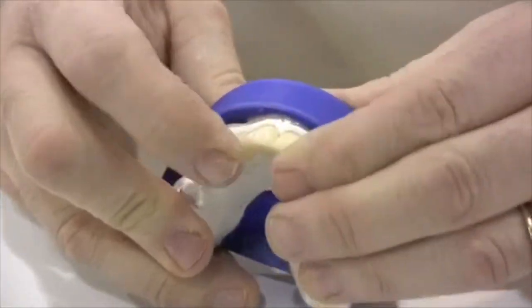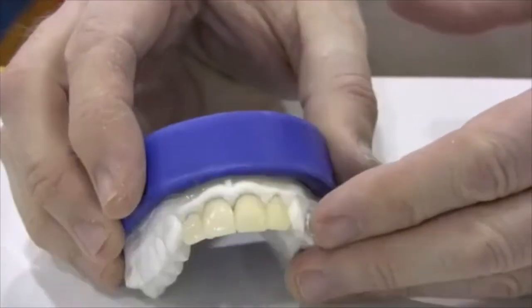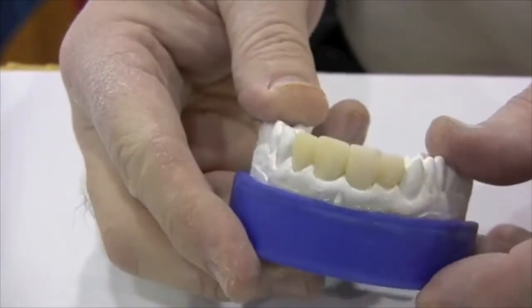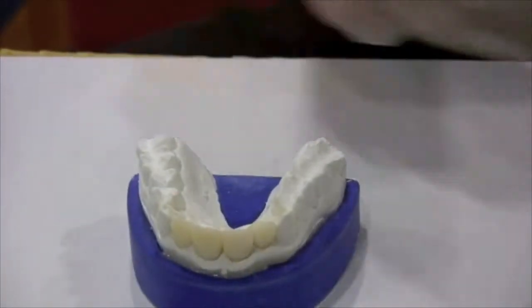Now a little bit of refinement still needs to be done, but you can see we are well on our way to creating a nice provisional restoration for this patient — using Tough Temp, the add-on materials, and the liquid glaze.